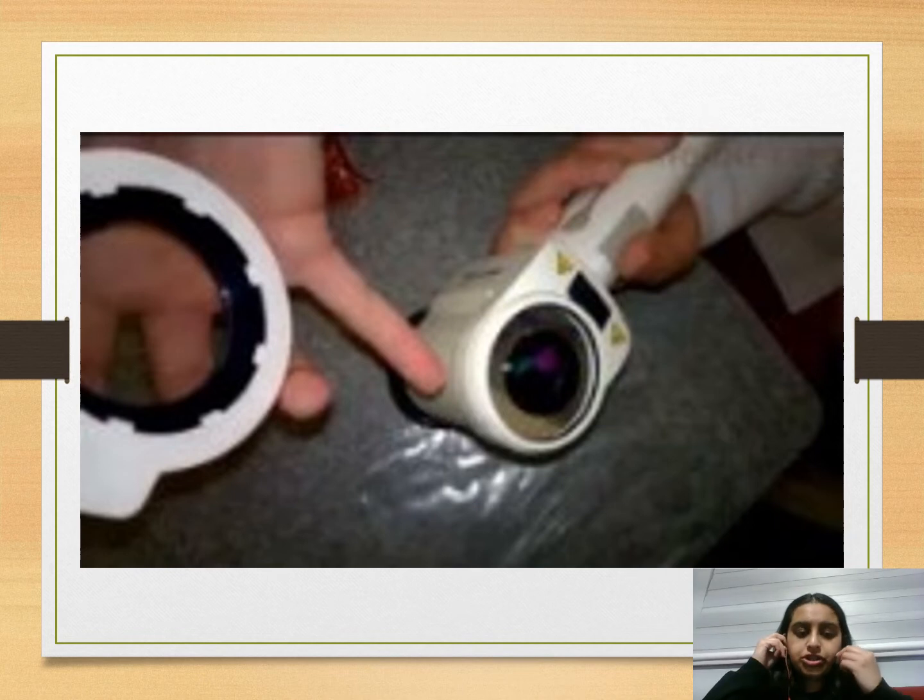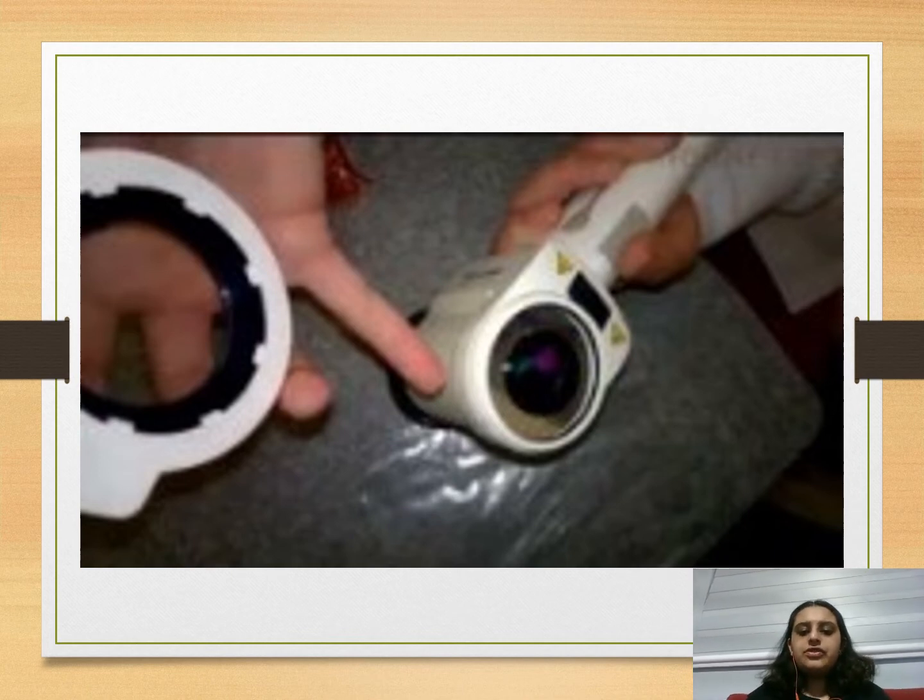And you want to hold it 8 centimeters away, so you don't need to be so exact on that, but generally you can't fit this whole thing inside your mouth, so just kind of drag along. You can actually take really good pictures. I've had a hygienist take some good pictures through the lens point there.